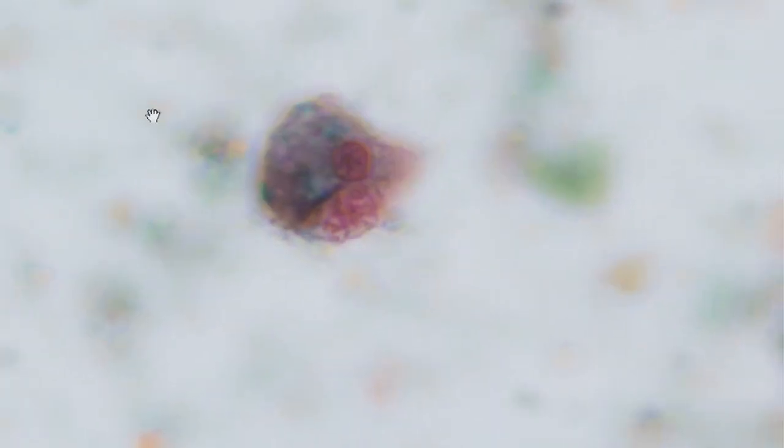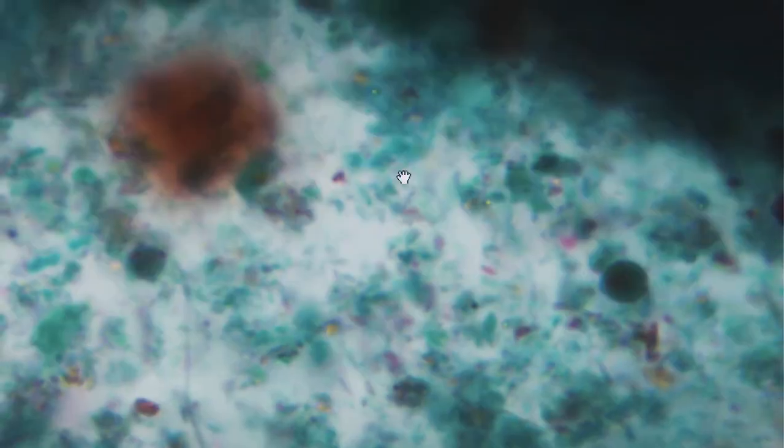And if we find cysts around the place, you tend to find those cysts, as I said, are very full of chromatoid bodies, and those chromatoid bodies are all sorts of bizarre shapes, lots of different shapes. Here's another trophozoite of Entamoeba polecki. Large, nice large nucleus. I just want to see if I can find one more cyst for you to show you just that mass of chromatoid bodies that you see in cysts and the very funny sickle shapes and pointed shapes of the chromatoid bodies within the cysts of Entamoeba polecki / chattoni or Entamoeba polecki-like organisms.